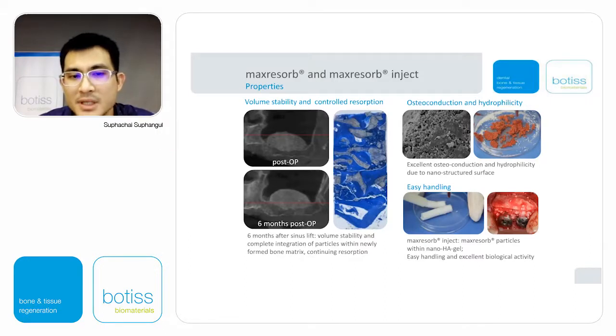But you can see after 6 months, the sinus lift, they have the volume stability property really well. However, they have the hydrophilic property, the same as the xenograft also.